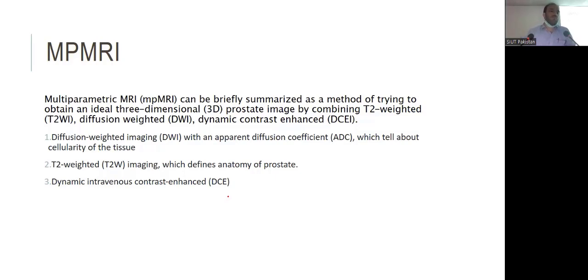Diffusion weighted imaging is required, because it is based on the principle of the motion of water molecules in any lesion. If the water molecule movement is restricted, that shows as restriction. Depending on that basic rule, any tumor or abscess which restricts water molecules appears as bright on DWI and hypointense on ADC.